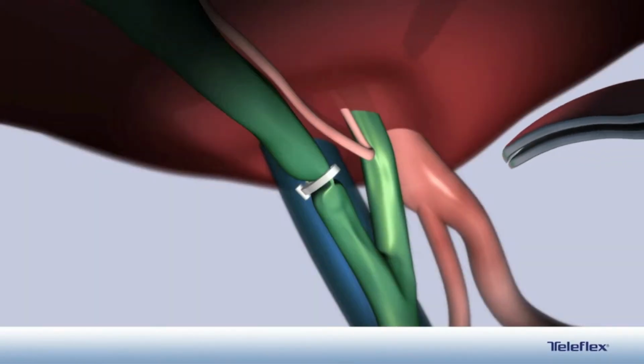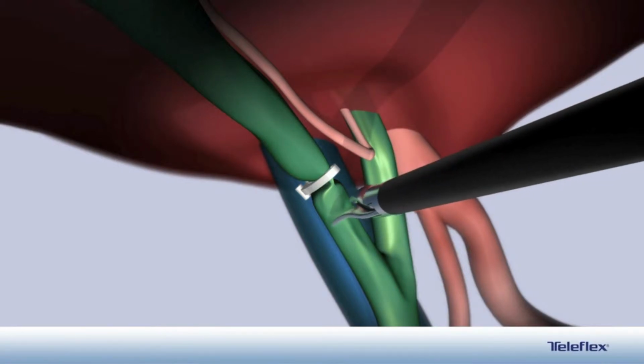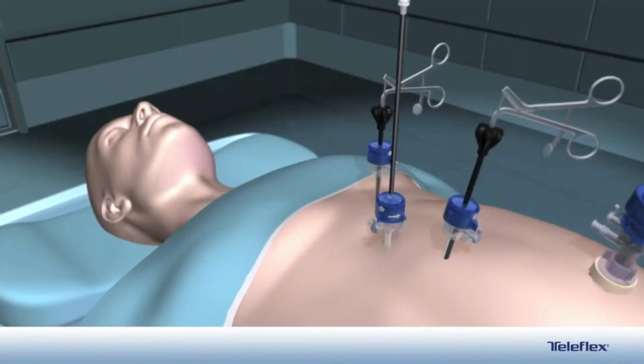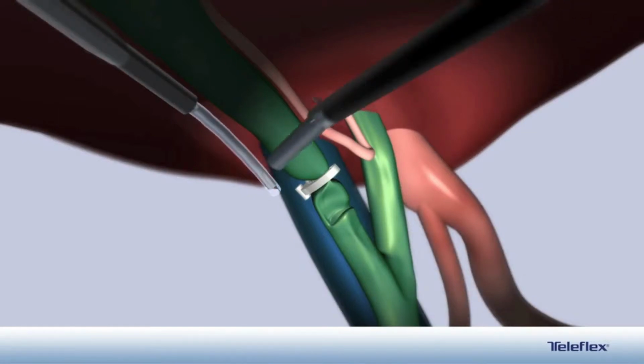A Pilling laparoscopic scissor is used to create a small opening in the cystic duct for insertion of the cholangiogram catheter. A peritoneal introducer is inserted through a 5 mm port into the abdominal cavity. An 18400 cholangiogram catheter is then inserted through the introducer and into the cystic duct.